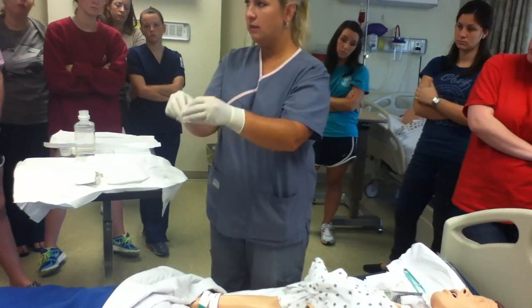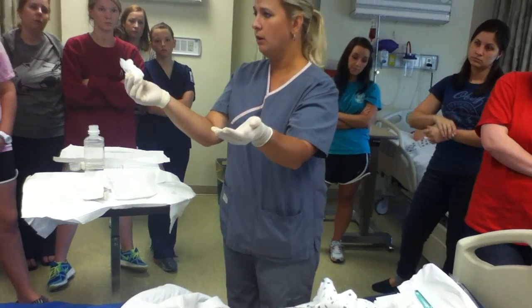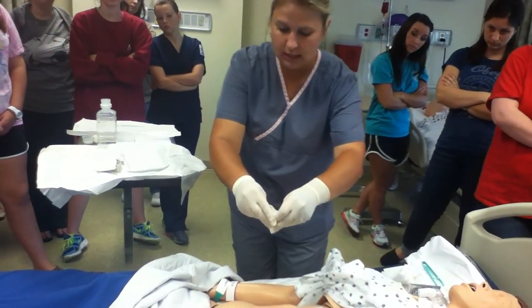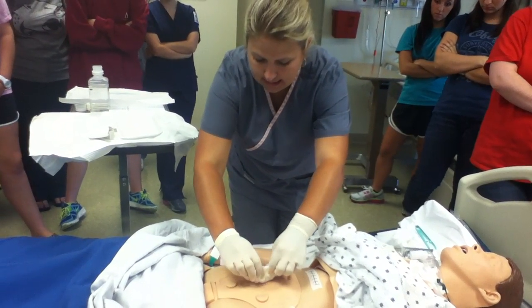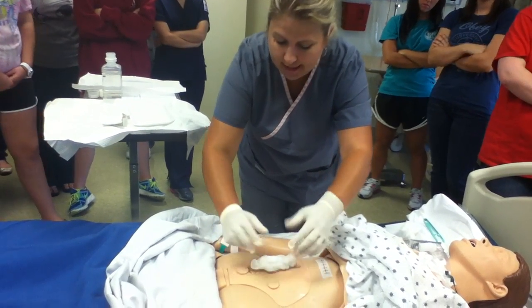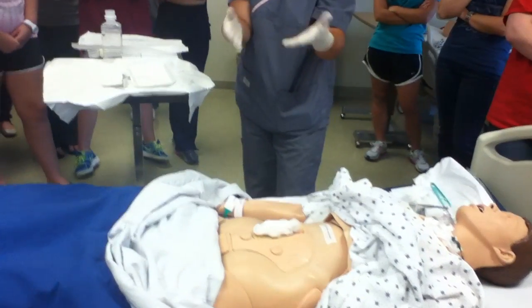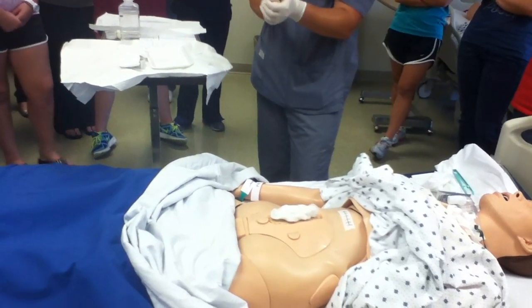Now, again, we have this itty bitty wound. It's hard to get the packing in the wound. If you have that great big decubitus ulcer, you can put a whole lot more of these in there, but we have to dress what we have. So what you need to do is do your best, get it real tight and skinny, and then put it actually on top of the wound. Don't freak out if it kind of somewhat poofs out. We understand that happens. Okay, so now I've got my wound packed with 4x4s.